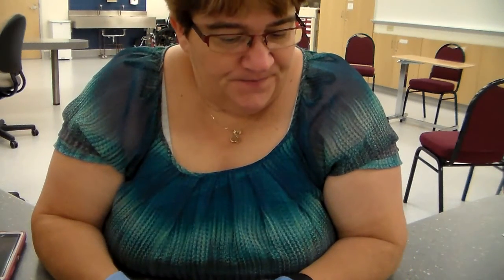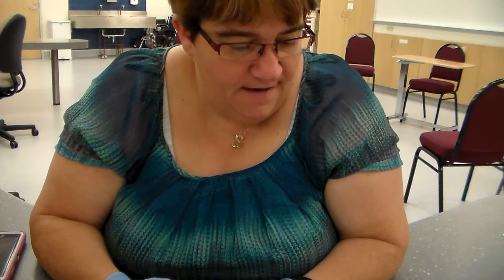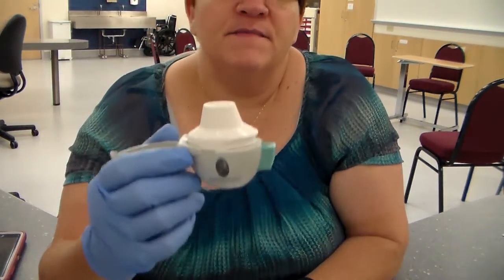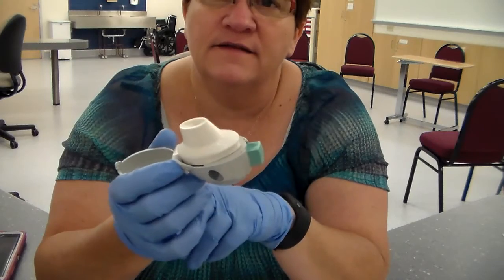You want them to breathe in slowly and deeply, as far in as they can get it. Then you're going to have them hold the deep breath as long as comfortable. So, hold, and then just return to a normal breathing pattern after that. If you feel that they did not get all of the medication with that one, it doesn't hurt for them to put their lips back around and breathe in again to make sure that they get all of the dry medication out of that capsule.